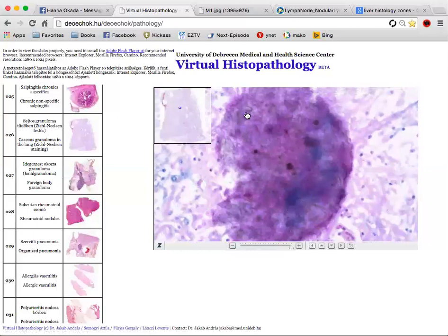And you see all these little things? That's the bacteria. But just imagine that you're seeing them through cells. That's why you can't really see them. You only sort of see them.